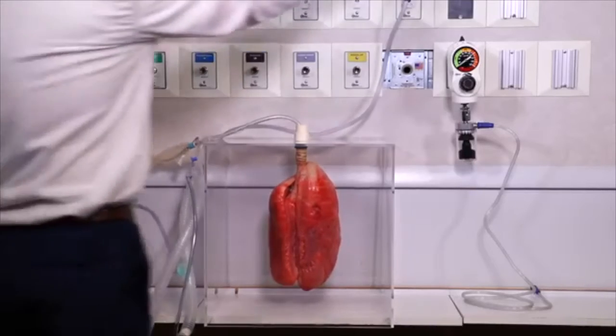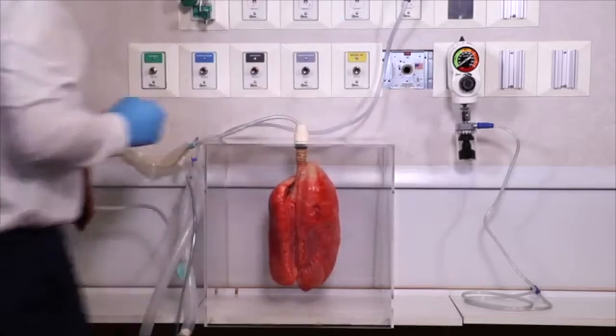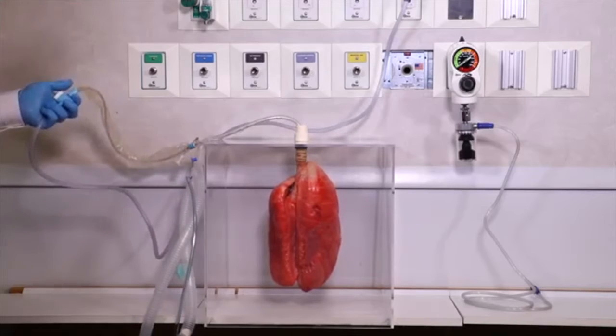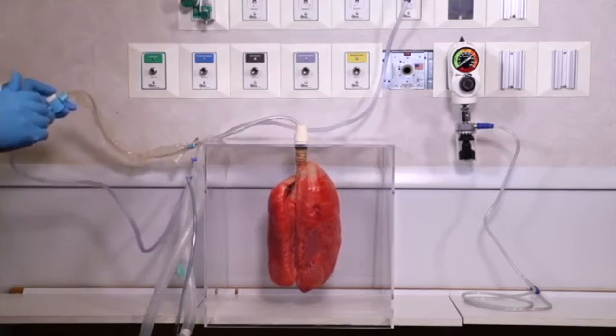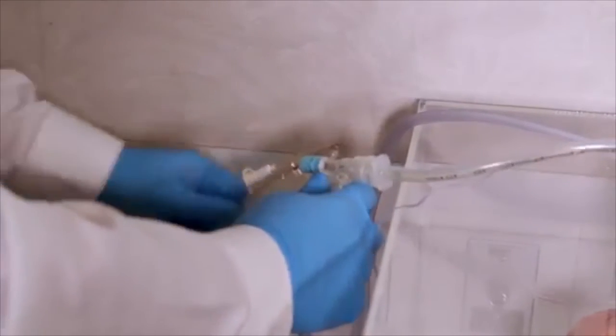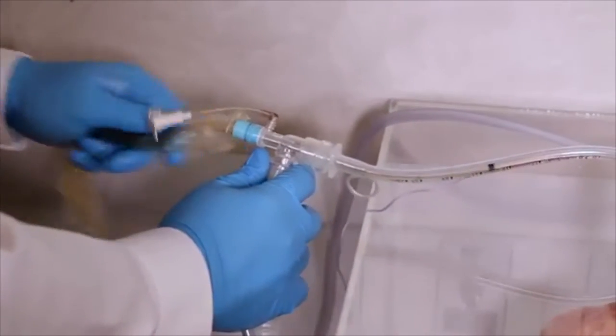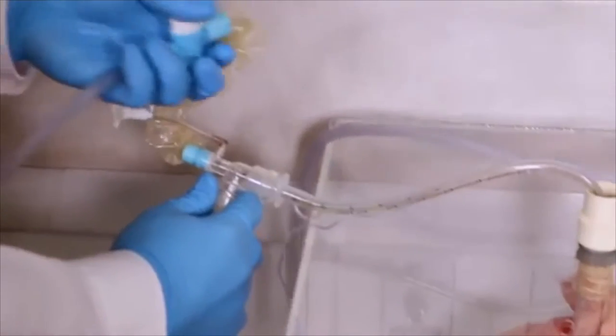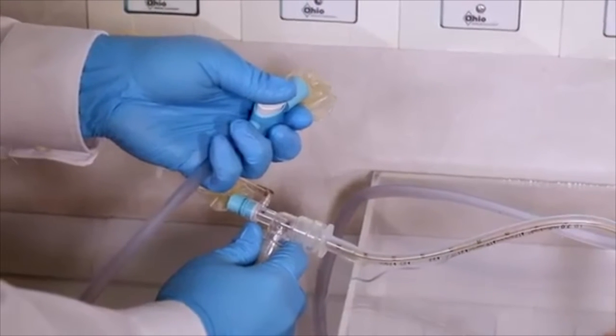To demonstrate how powerful full wall suction pressure can actually be, I'm ventilating a set of actual real pig lungs with a mechanical ventilator on significant settings like you would find in a patient with ARDS — low tidal volume and a really high PEEP of 20. You can see the lungs are inflated during ventilation. I'm going to advance the catheter, apply suction at full wall for just a few seconds, and I want you to watch what happens to these lungs.